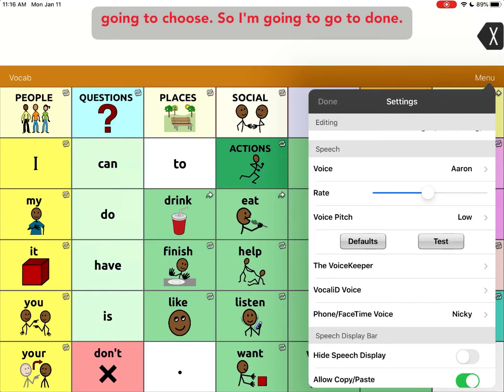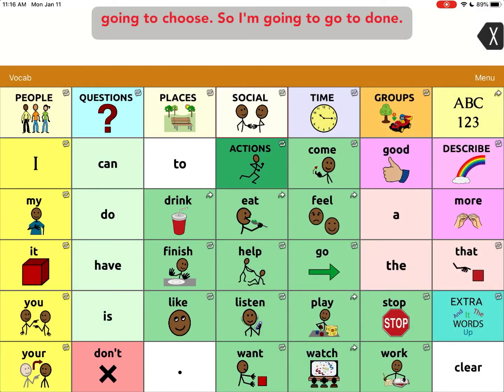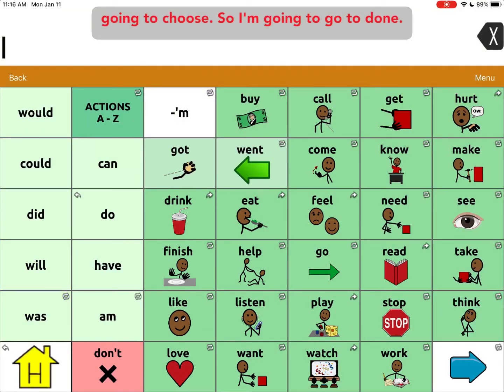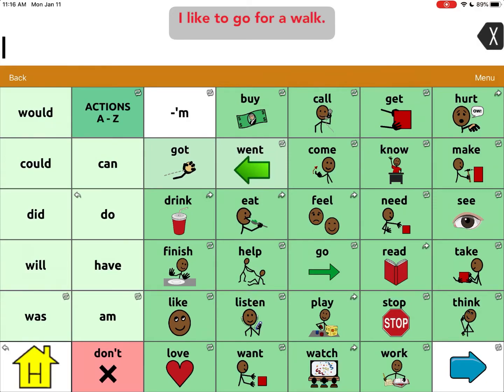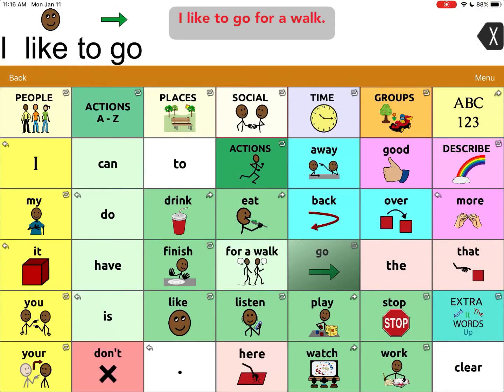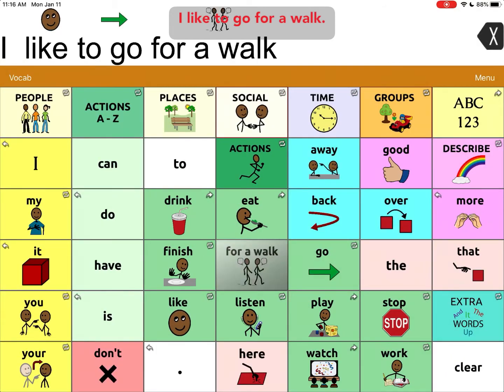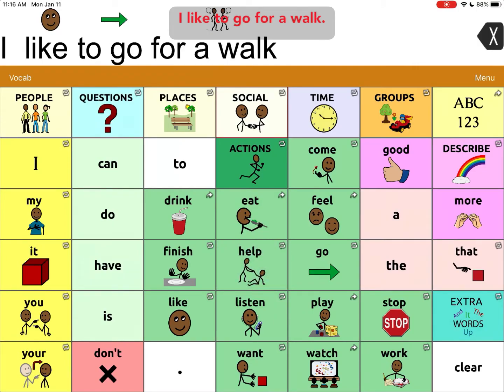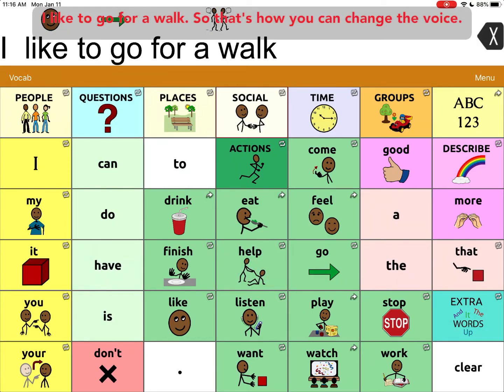So I'm going to go to done. And now: 'I like to go for a walk.' So that's how you can change the voice.